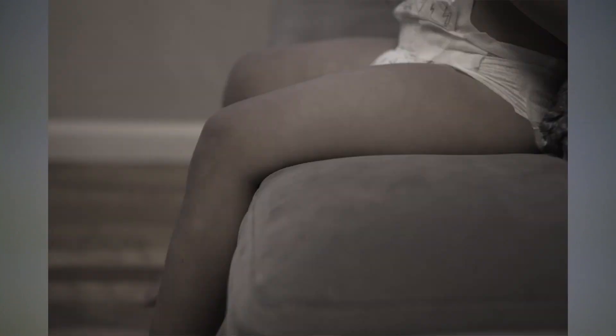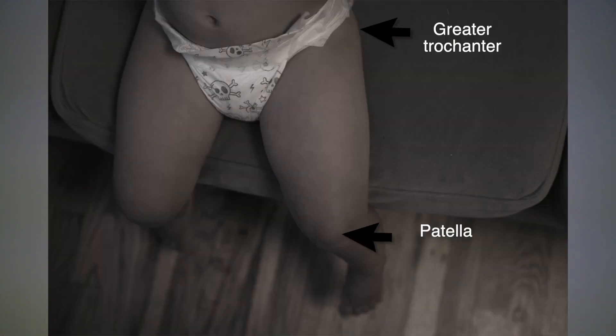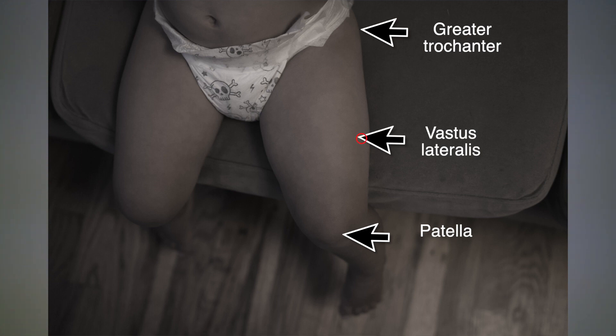Under 2 years of age, you'll inject into the anterior lateral side of the child's thigh. For the 1 and 2 year old, use a 1 inch or 1.25 inch needle length. Make sure the toddler's legs are completely exposed. Locate the upper greater trochanter and the lower patella of the kneecap, draw an imaginary line between them, then divide the thigh into thirds — the vastus lateralis is located in the middle outer aspect of the thigh.